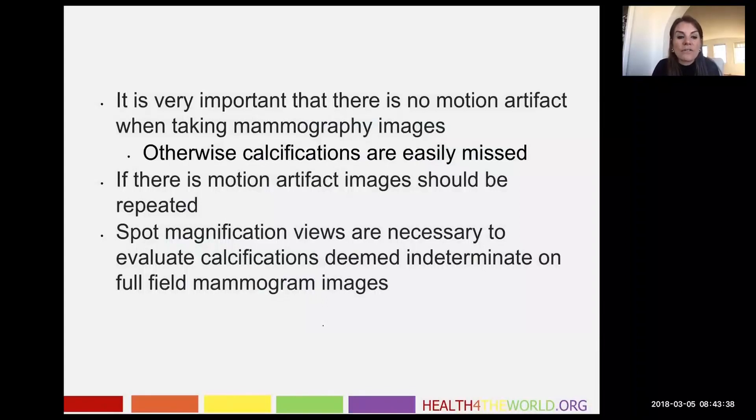Motion artifact blurs the image and it's easy to miss calcifications — we just can't see them if the patient moves and there's motion artifact. So if you do see motion artifact, your images should be repeated, because it is possible that we could miss a small early cancer related to motion artifact.